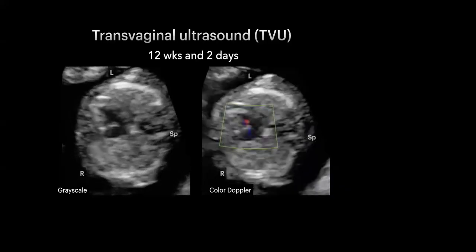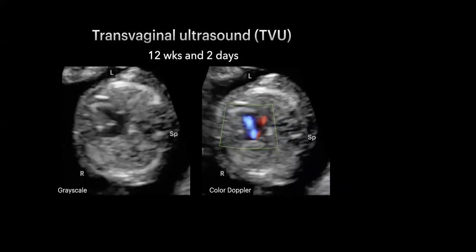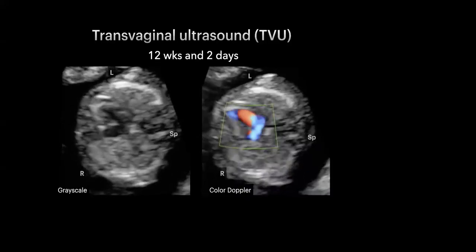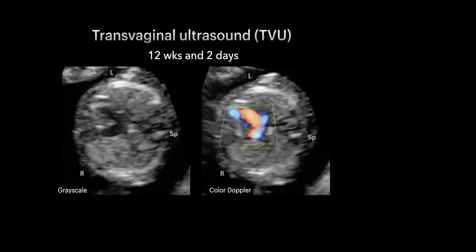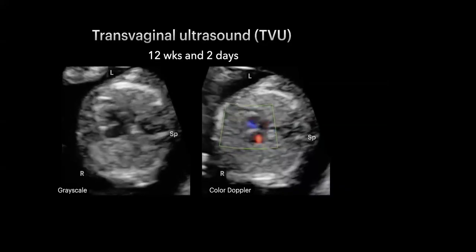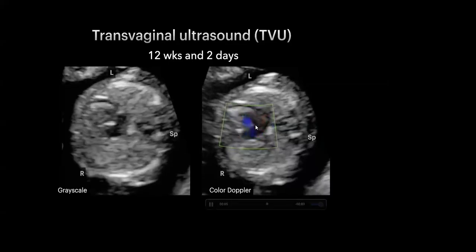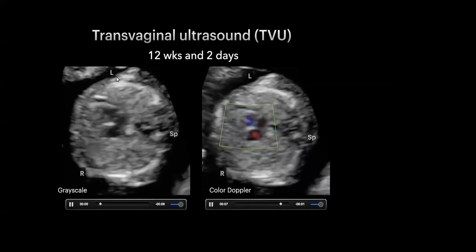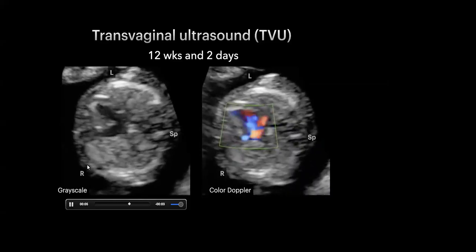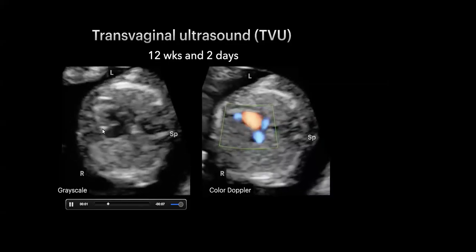Well, we're going to go ahead and move on to transvaginal imaging because we are able to assess the structures clearly and, of course, bring us closer to the structure of interrogation. So we optimize by using transvaginal imaging, optimize our grayscale settings, and this is actually what we see. So now that we determined situs transabdominally, here you can see the spine. This is baby's left side, as well as the right side. And of course, you could see what looks to be a diminutive right ventricle.